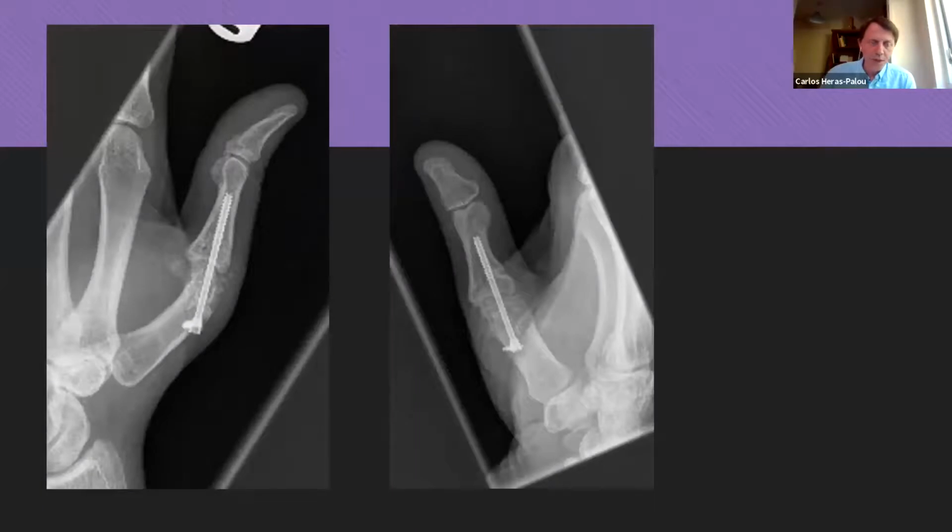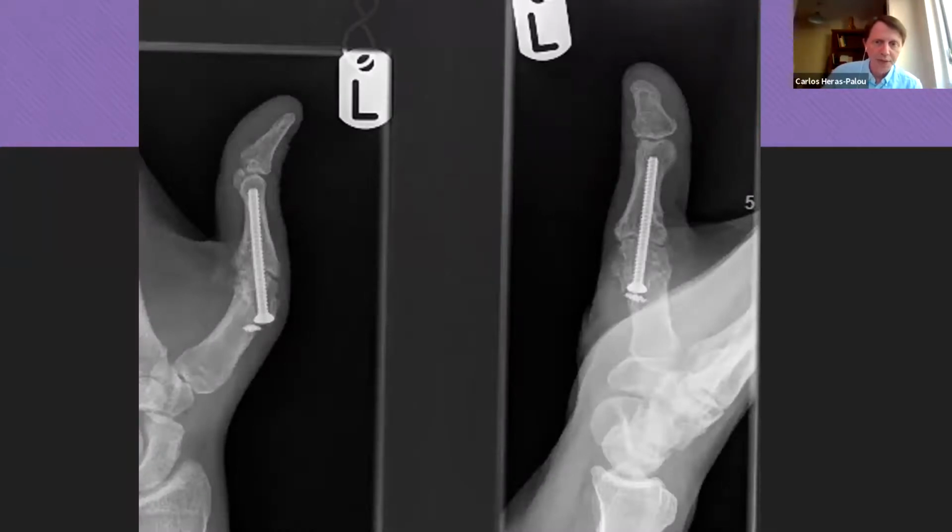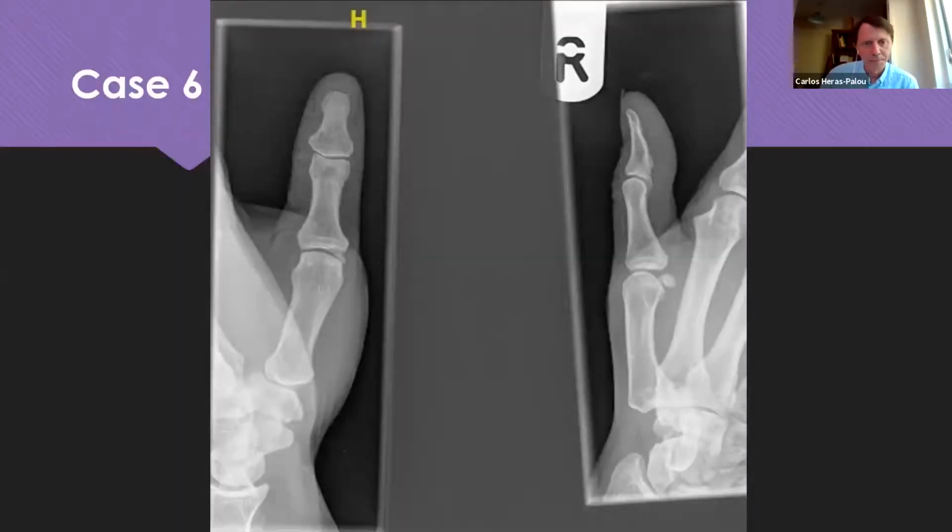So what I did, I went back, took it out, and in one of the holes of the K-wire, put a long cannulated screw, and then he was fine for a few months, and then he fell over and started being painful again, and probably had not healed properly, and he cracked that. So just through a small hole, I took that screw out and put a bigger screw, gave it a bit more compression, and then finally healed. So this one demonstrates several techniques for the MCP arthrodesis. And it is rare that they don't unite in my experience, but it can happen. So you need to be careful with that.